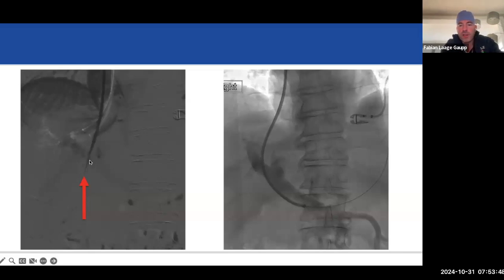So you puncture in, and you have a small syringe on the back filled with a little bit of contrast, like a quarter or a third of the syringe. As you're pulling back, you're aspirating. Once you go through the portal vein, you should get blood back, and then to confirm, you inject contrast. As soon as you have confirmed that you're in the portal vein, you get a wire down.